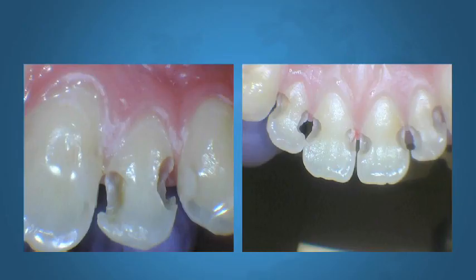Now in this slide, you can see those class 3 preparations again, where the external outlines are smaller than the internal outlines, allowing me to really stay supra-gingival on all the preparations, keep the external outline smaller, doing the repair. The filling is going to be a lot simpler when I do it like this than if I do the traditional, where the internal outline has to match the external outline. Then on every single one of these preparations, I would have been far below the gum and have to deal with bleeding, have to deal with difficulty achieving good contours, etc., etc.